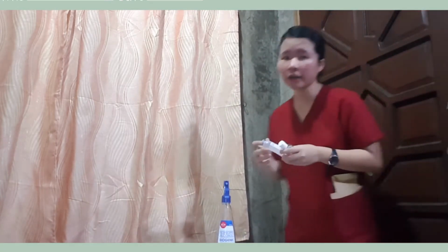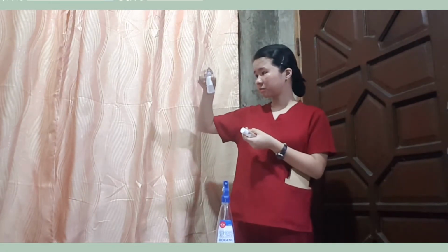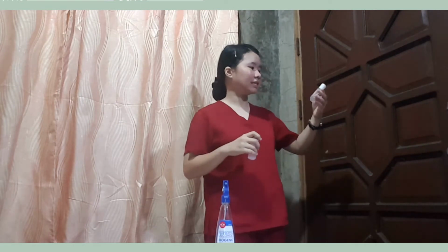We're now going to check for the clarity of the regular insulin and the cloudiness of the intermediate insulin. By doing this, it ensures the safety of the patient.